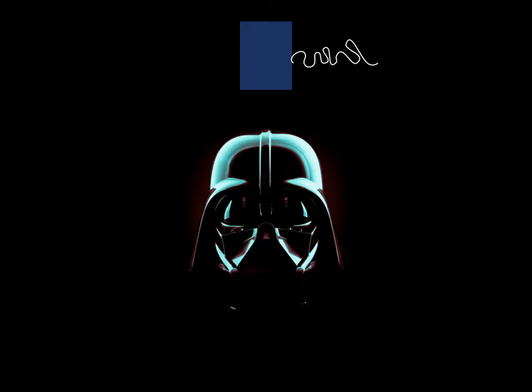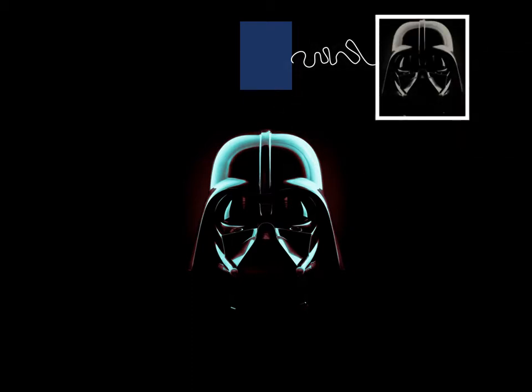2D real-time imaging is obtained by sweeping the ultrasound beam across the imaging plane. The image is formed one line at a time. These lines are then added together to form one frame. Brightness of the dots on the display is proportional to the amplitude of the returning echoes from anatomical interfaces encountered, and the position of the dots is dependent upon the round-trip time of the pulse and the speed of sound in that medium.